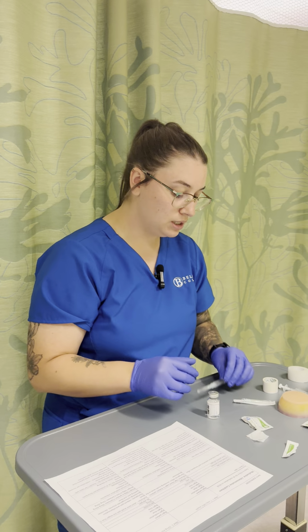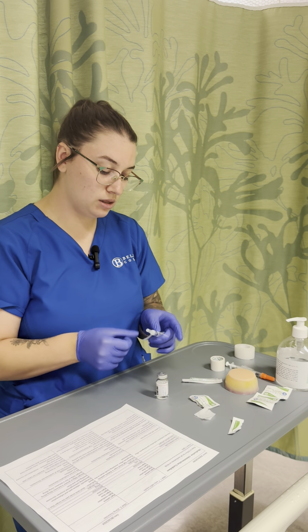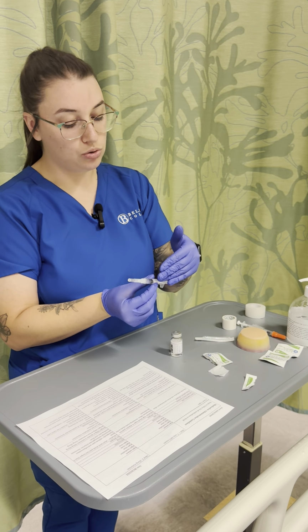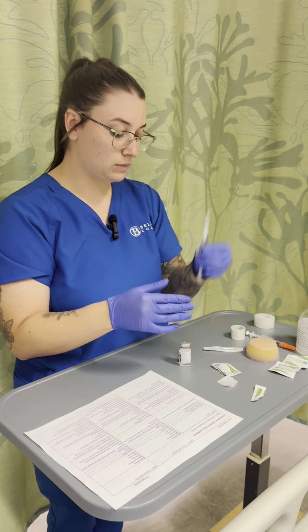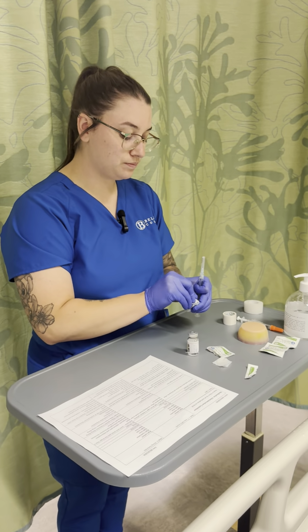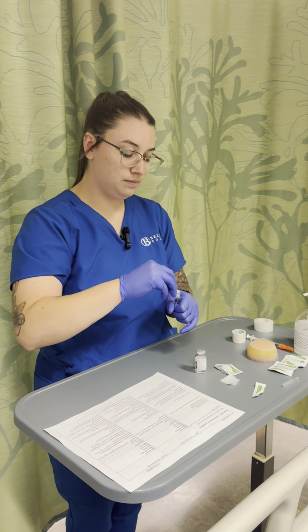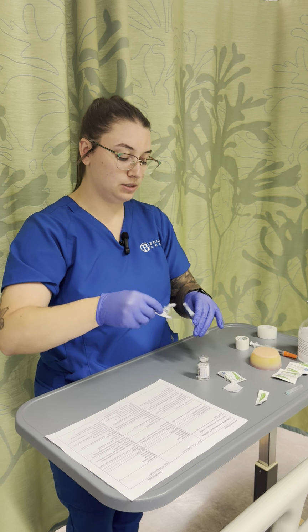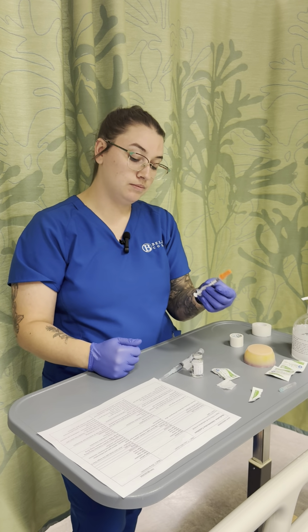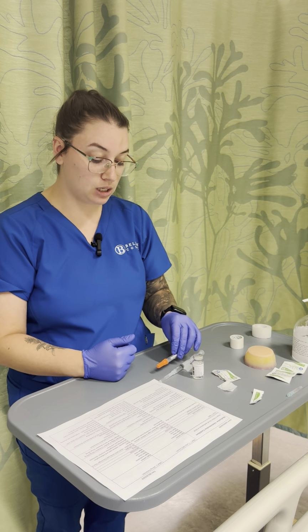Again, no bubbles. I will be labeling my medication with a label that has the patient's name, my name, the time, the dose, and the route on here. I am also going to switch my needles. This would go immediately into a sharps container. All right, so I have my 1.3 ketorolac. I have my 7 units of insulin. The safe dosage for this is 0.4 to 1 units per kilogram a day.